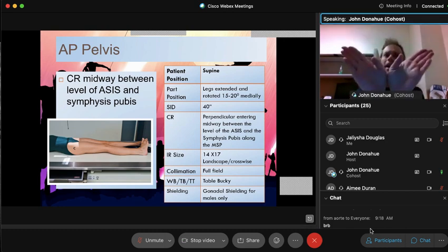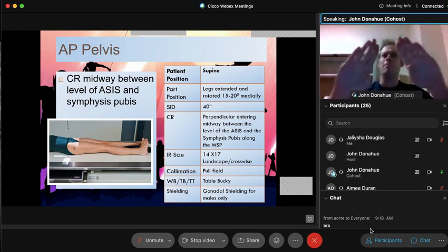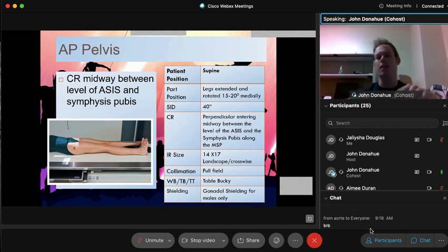We don't want the feet going to the sides. That's going to be improper position. They must have those feet internally rotated. And that's probably what people miss the most on a pelvis x-ray. You put a big star on that. You always got to rotate those feet medially. Otherwise, it's going to be improperly positioned on that pelvis. A lot of people will be in a hurry. They'll be doing a competency. You'll be doing a test out. You get everything just right, you forget to turn the feet inwards. Do not forget that very important detail on that pelvis x-ray.